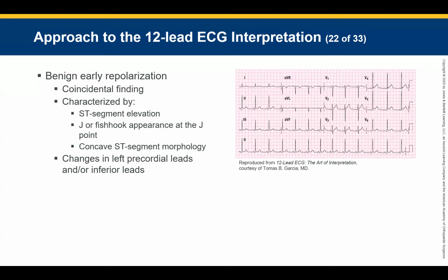There's nothing inherently wrong. Nothing. It really doesn't matter that much. It's a coincidental finding on an EKG, meaning we don't give a damn.